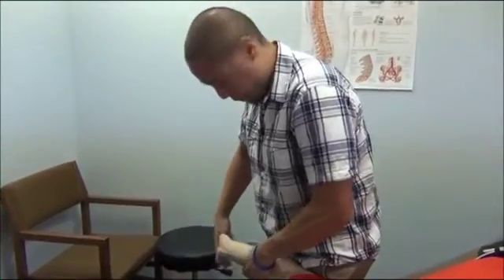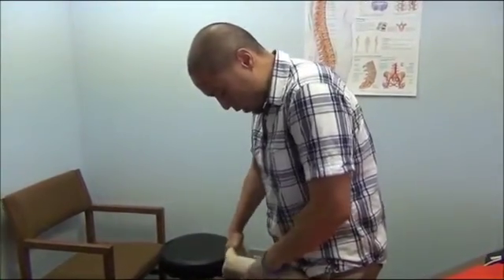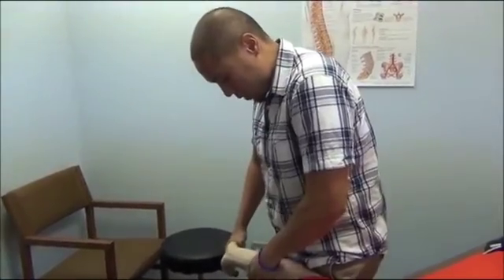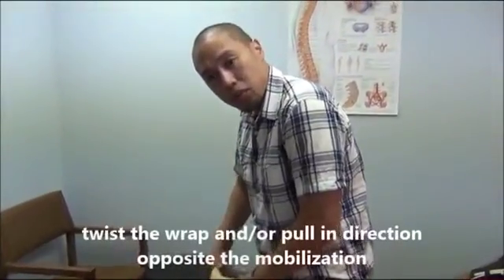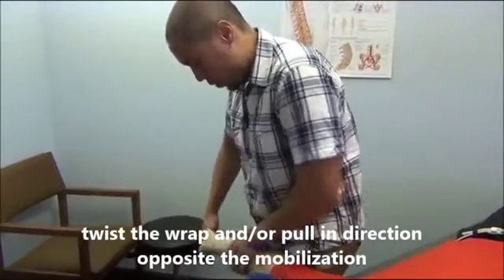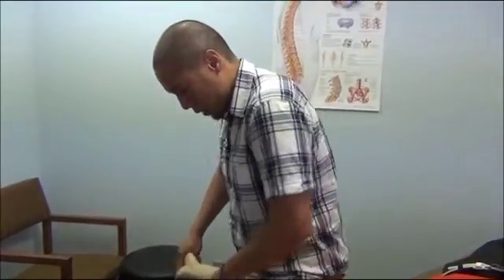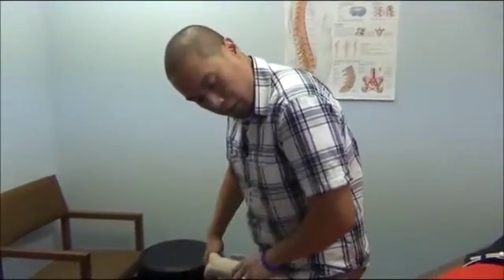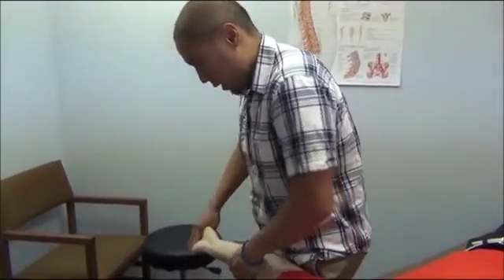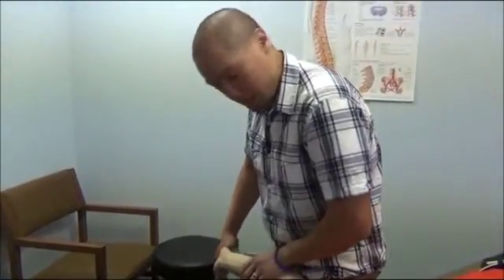You feel that? Mm-hmm. If I was actually doing supination, I can twist the skin under the band in the opposite direction, or I can kind of combine those techniques for a little bit more stretch, twist in the opposite direction, and also pull. You feel stretch with that? Yeah. So then I'm just doing a tissue mobilization and a kind of twist.